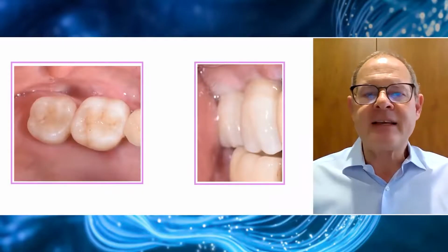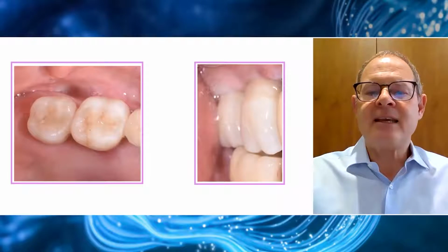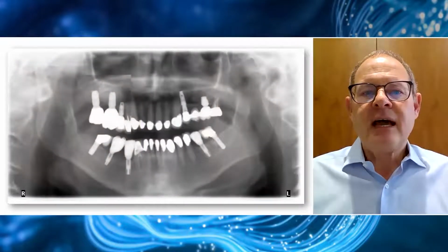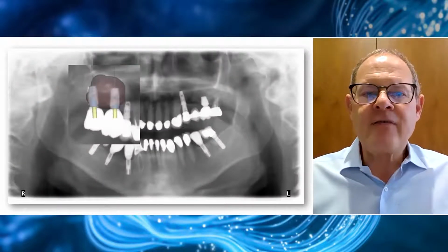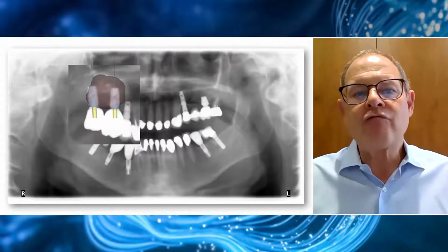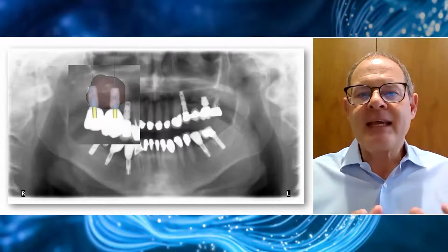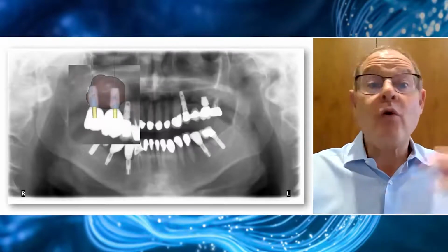And these provide really phenomenally high quality and biologically stable restorations. And then if we now take the final radiograph, we can very quickly see how that ties back into our original digital plan, placing everything exactly as was intended before we commenced with surgery.